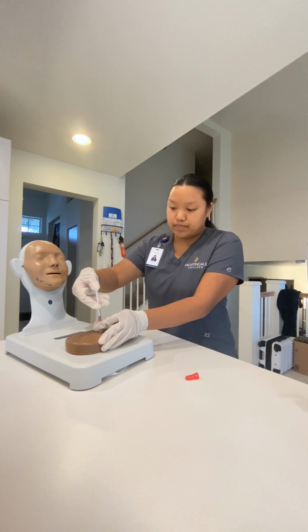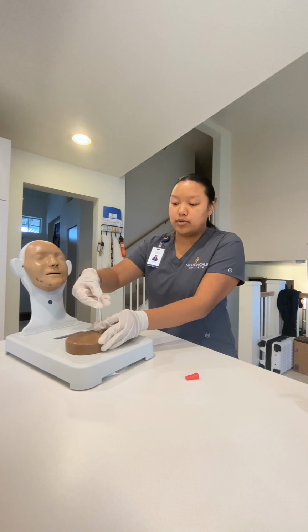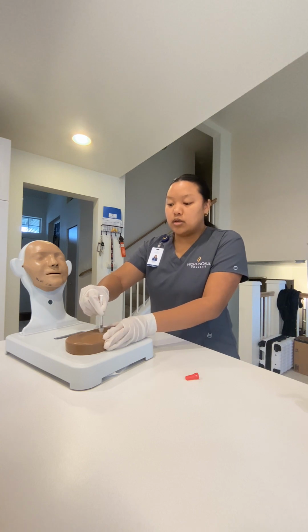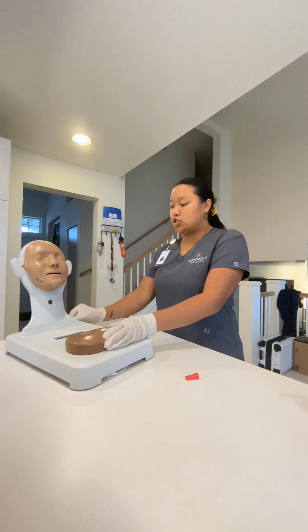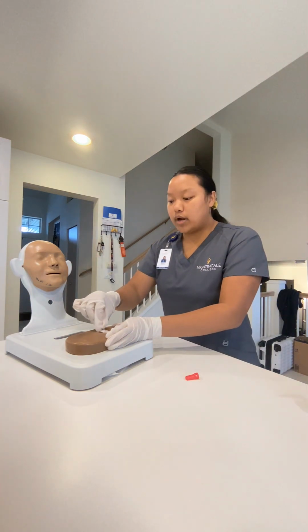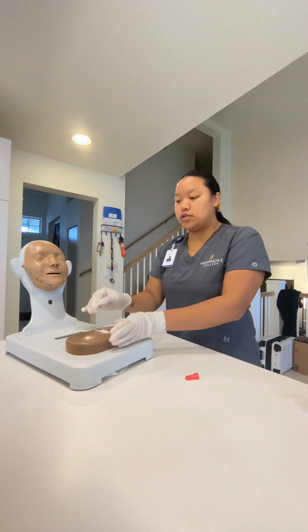Using my pointer finger and my thumb to stabilize it, and I'm injecting. There you go. All done injecting. Now I'm gonna just hold it, and I'm gonna pull it out. And then I'm gonna put my needle in the sharps container, and I'm gonna get an alcohol swab and put it right on the area of injection.